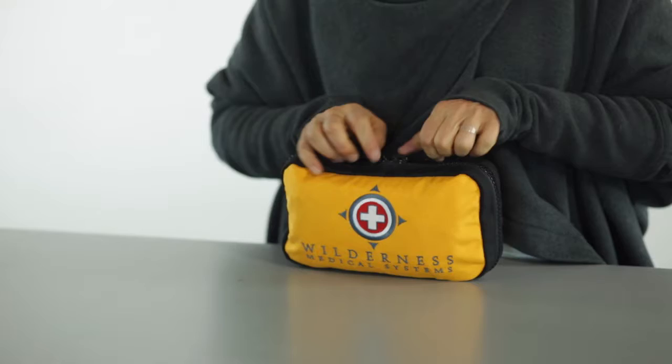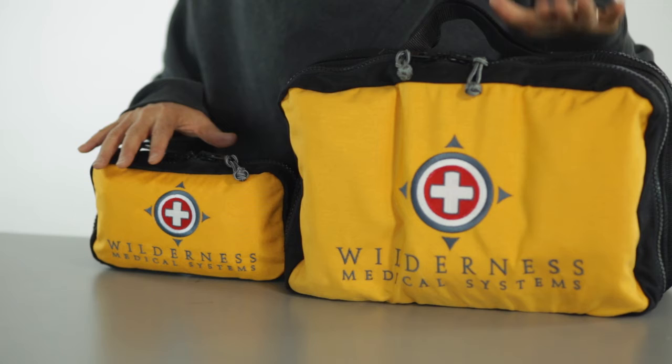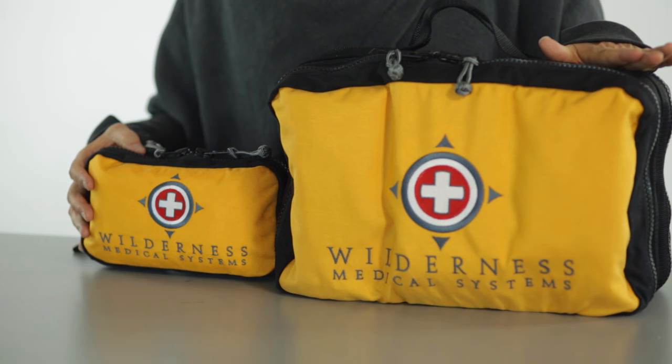The Mayfly is great for one to two people for a couple of minor incidents, but it's really designed to work in concert or in pairing with a larger kit. Here we have the Mayfly with our Pamir kit.